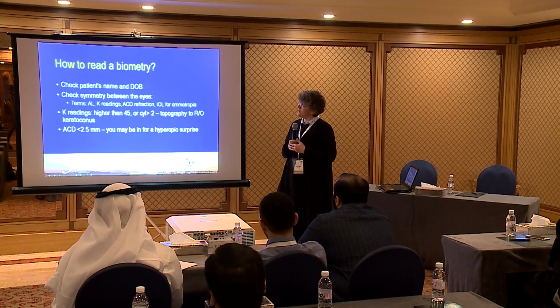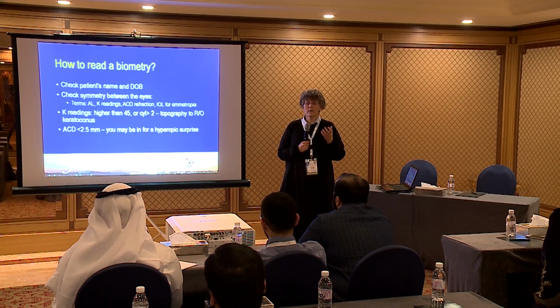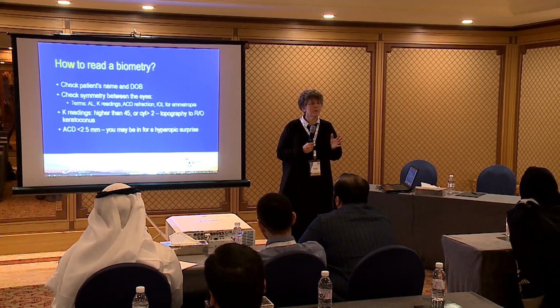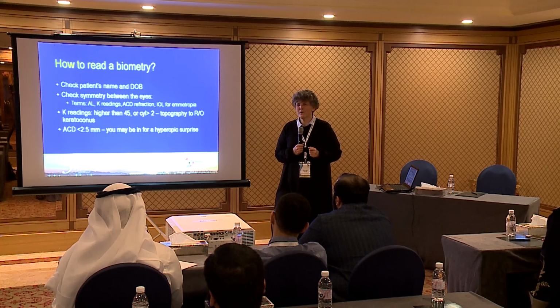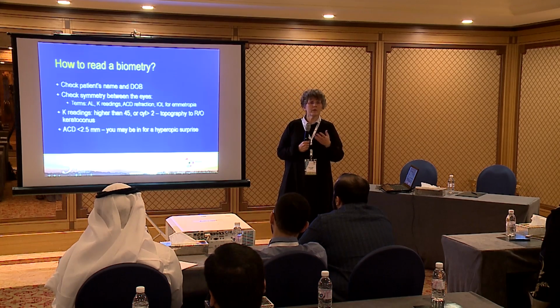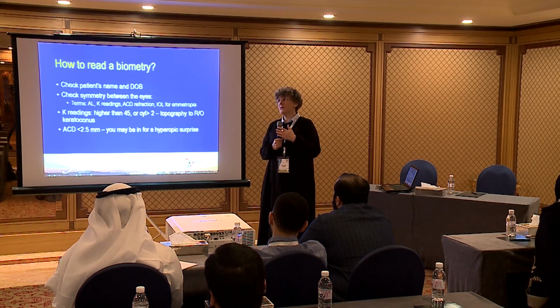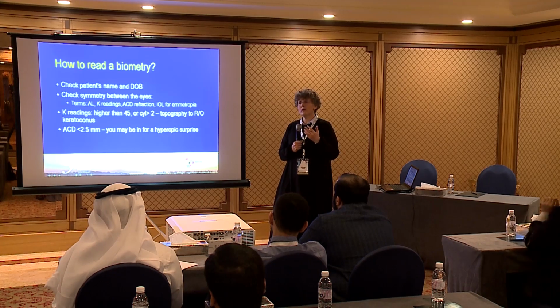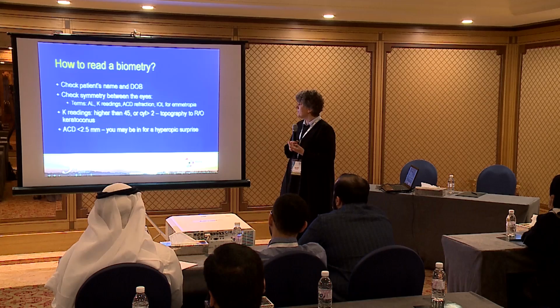You can say, everyone who has a cylinder higher than 2, I'll do a topography on. You know that in the population, 20 to 30% of people have a cylinder bigger than 1.25, but less than 1% have a cylinder bigger than 2. So here you have to decide what kind of error you are willing to incorporate into your practice. What's your cutoff? And I told you, in one practice my cutoff is much different from the other practice. And it's all regulated by whoever is our boss, okay?